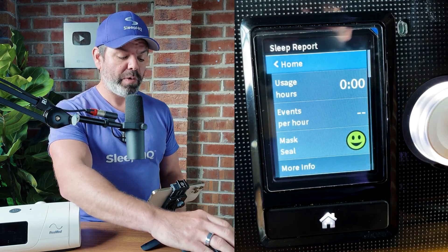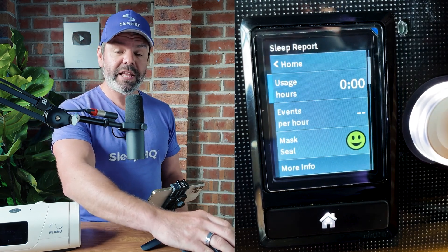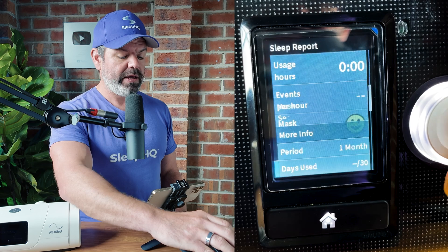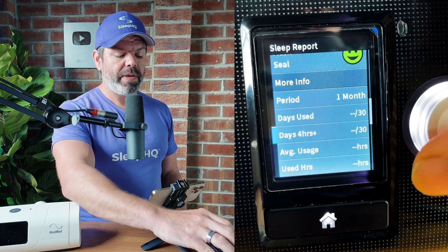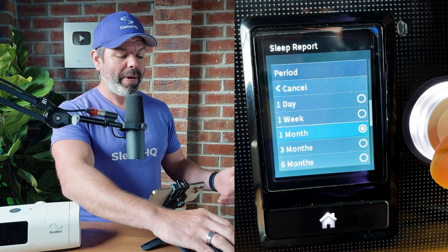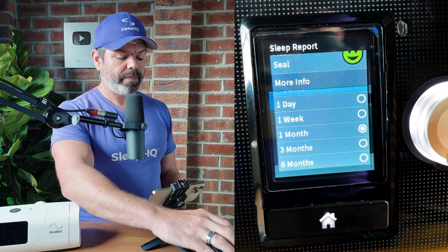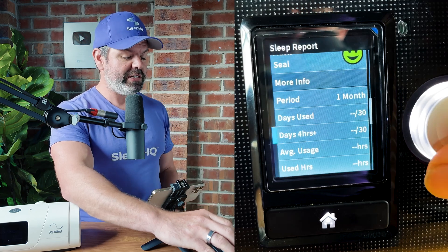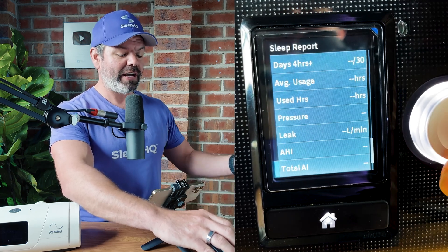Now let's check out the sleep report. Look — lots more information! We've got usage hours, events per hour (that wasn't there before), our mask info, and we can keep scrolling down. We can change the time frame from one week, one day, one month, three months, six months — whatever we like. We've got days used, days four hours plus, average usage, pressure, leak, AHI, total apnea index, central apnea index. I'm not going to go through what they all mean today — I've done plenty of videos on this — I just want to show you how to get in there and access 80% more data.